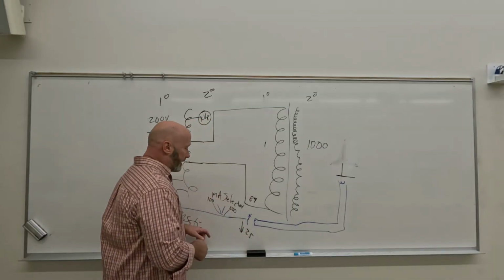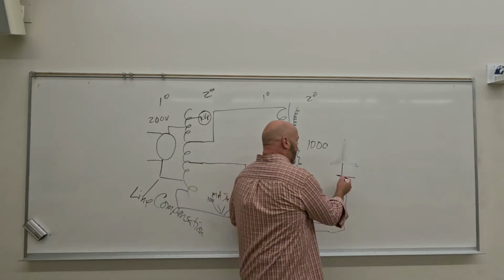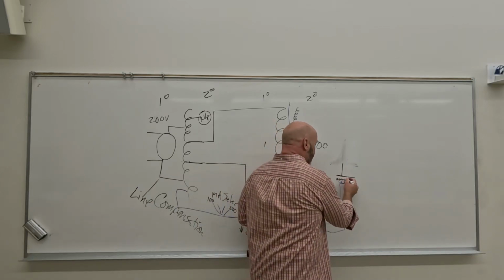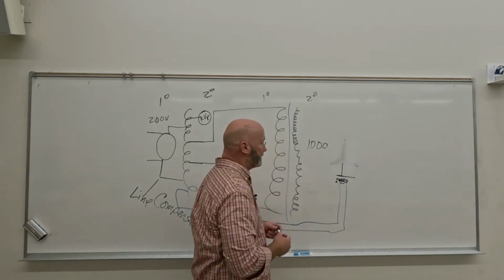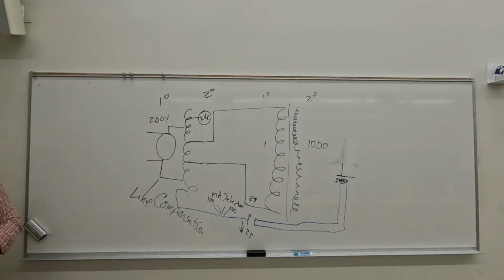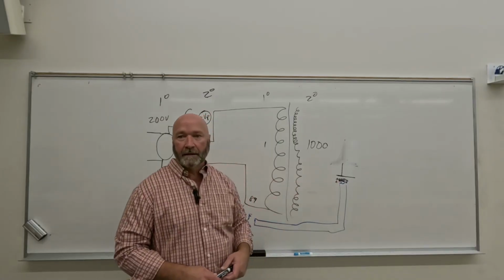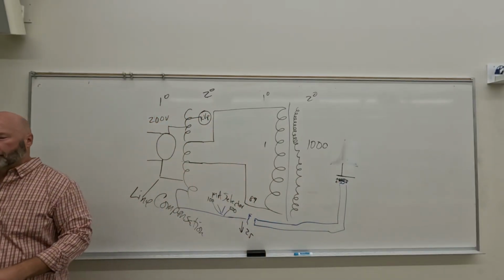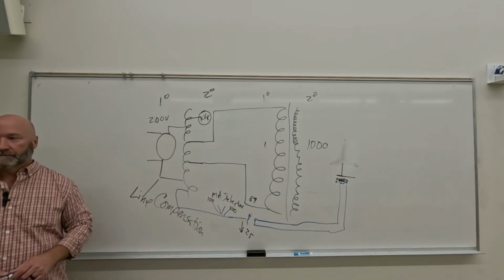Now when we push the prep button, we're going to have voltage low enough that electrons won't fly across the X-ray tube, but we have amperage high enough, and amperage really is going to be relatively high compared to what you're thinking. Our tube current, once we make an exposure, what do we measure our tube current in? Milliamps, right? Thousandths of amps. So our filament current is going to be quite high compared to that. It's going to be, what does he say, 3 to 5 amps? So that would be 3,000 to 5,000 milliamps, right?